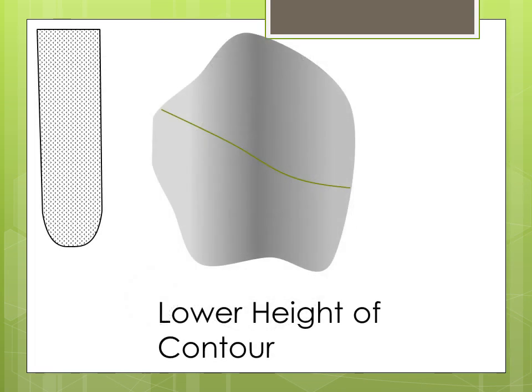Okay, Dr. Goon. It seems as though we'll be using suprabulge clasps, owing to the fact that the patient has frenal attachments which could interfere with placement of a bar clasp. We've marked the height of contour of the abutment. What's the deal here?